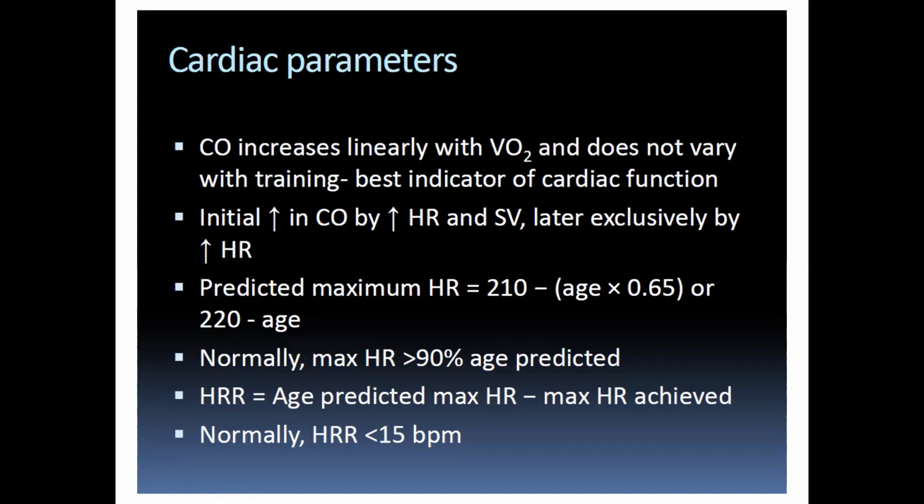The reason why we use multiple checkpoints is because there's a lot of variability in interpretation of where the ventilatory threshold occurred. So the recommendation is to look at at least 3-4 variables, and see if they concur with each other. Sometimes 2 or 3 are in agreement and 1 is off, so you'll use the one that is more in agreement. So the idea is to use several, not one or the other, but the one most commonly used is the V-slope method.